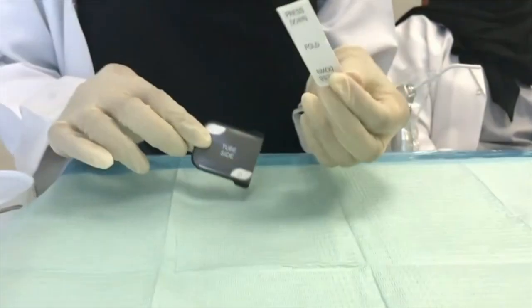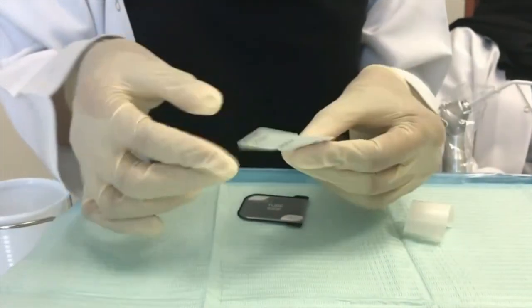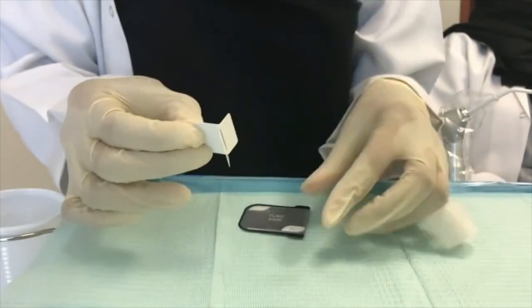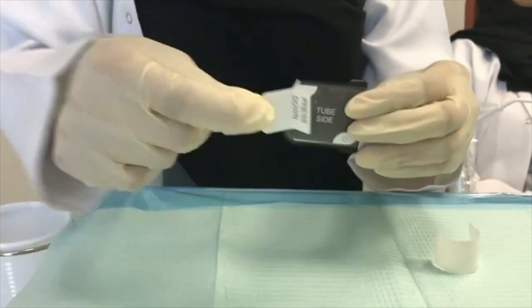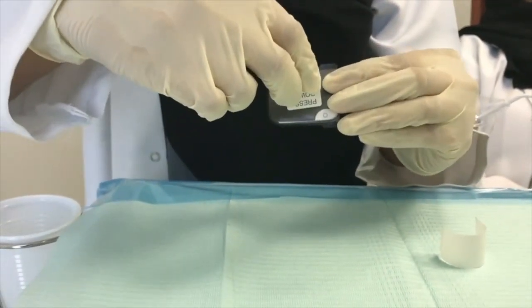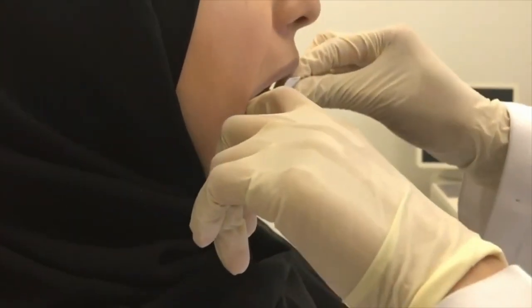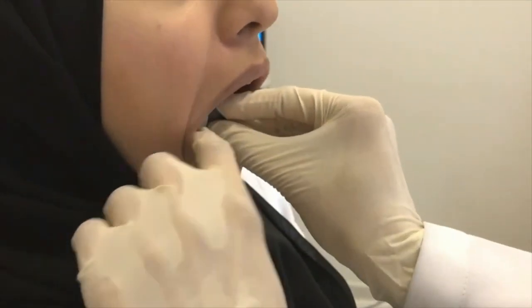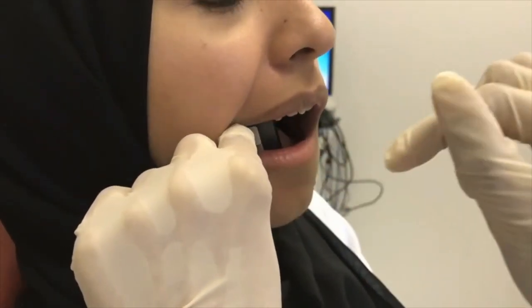The tab should be positioned in the middle of the film, facing the x-ray tube head. The patient's head should be supported against the headrest. The film should be tilted to facilitate insertion. Place the film behind the teeth in question. The patient is asked to close the teeth firmly together on the tab.